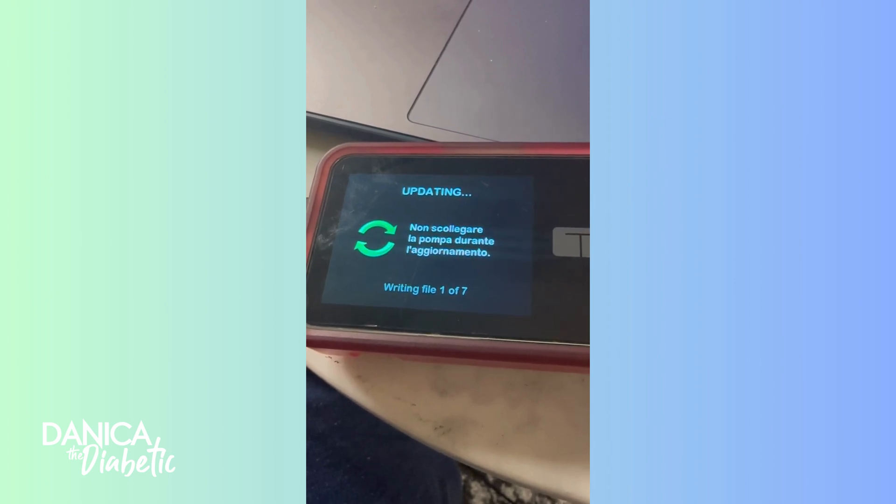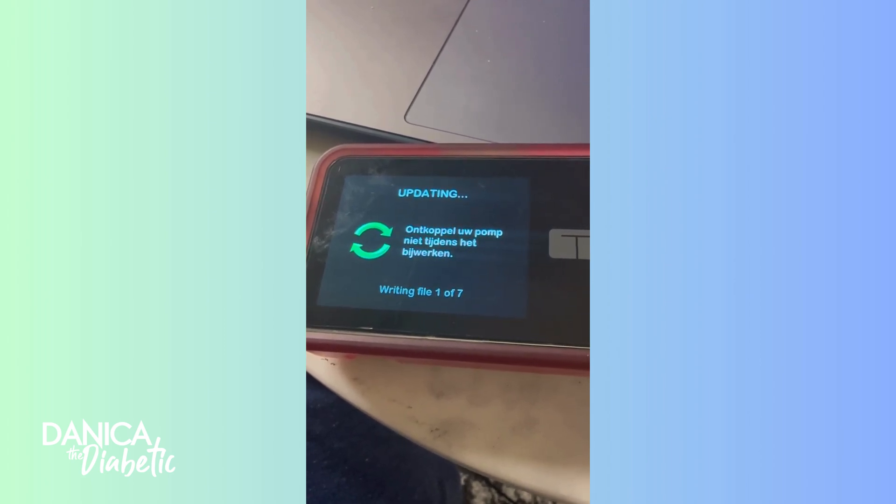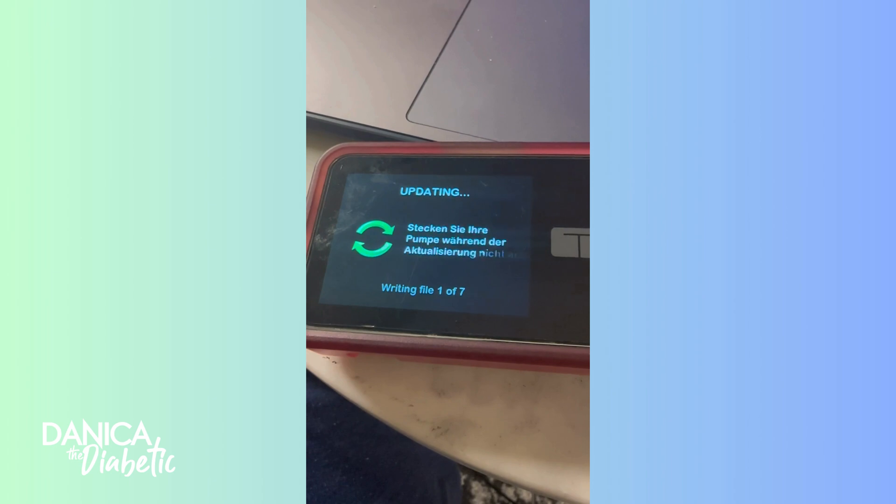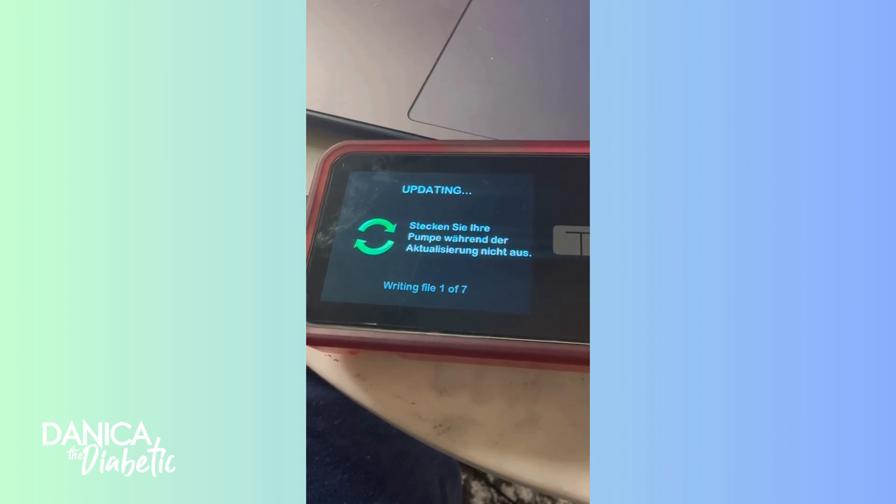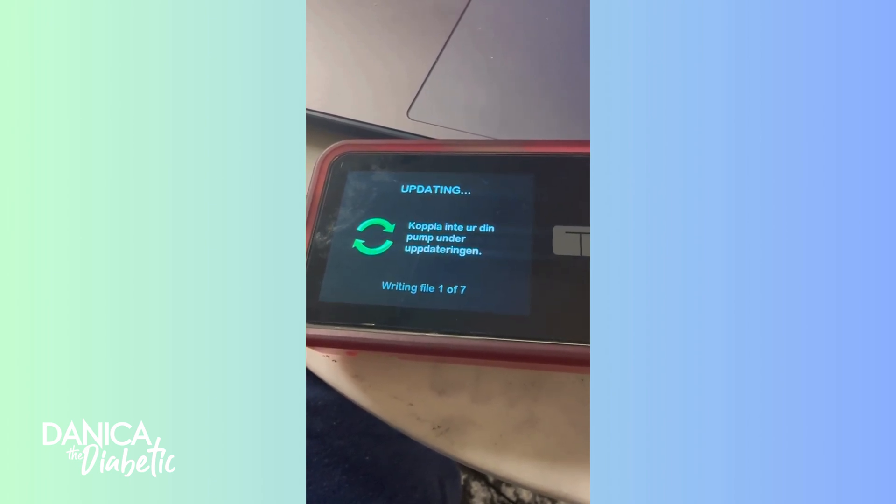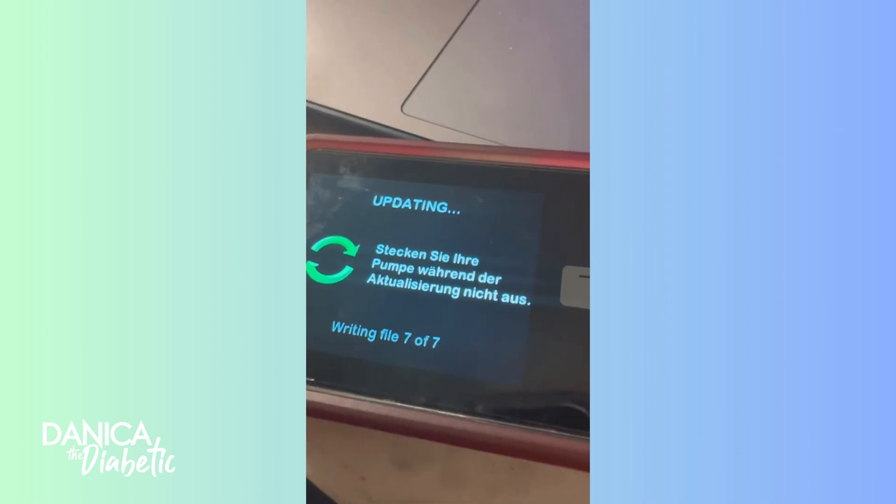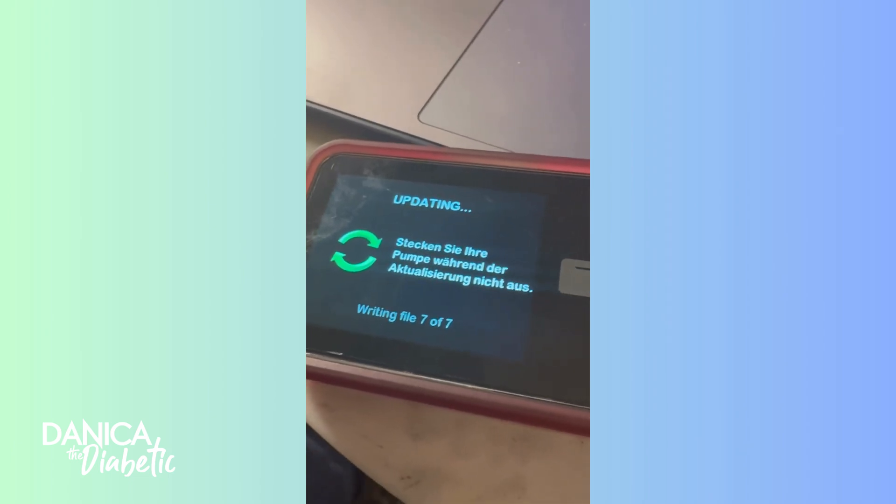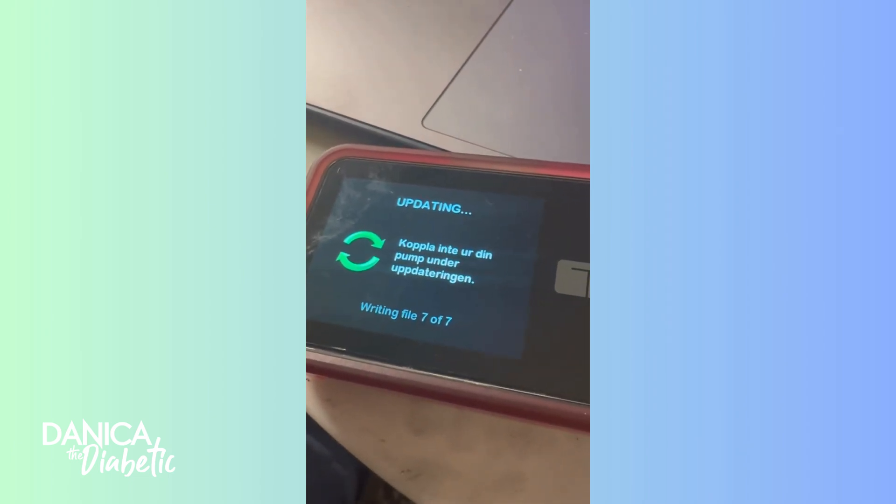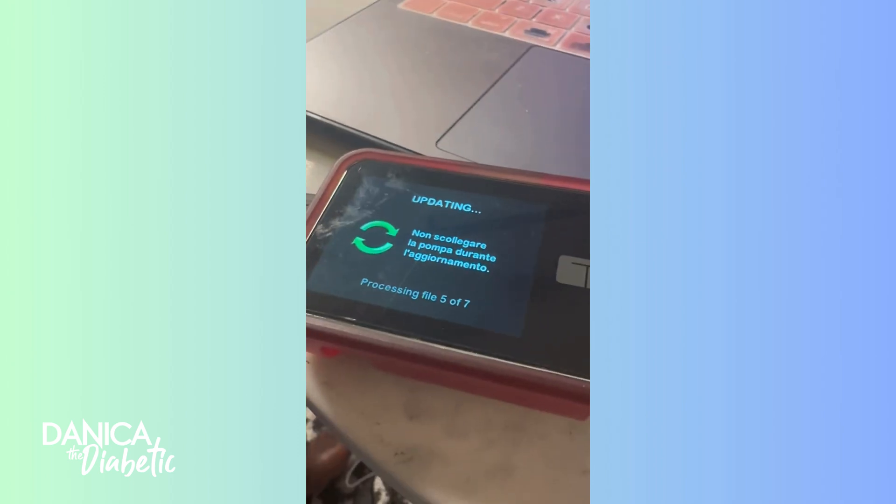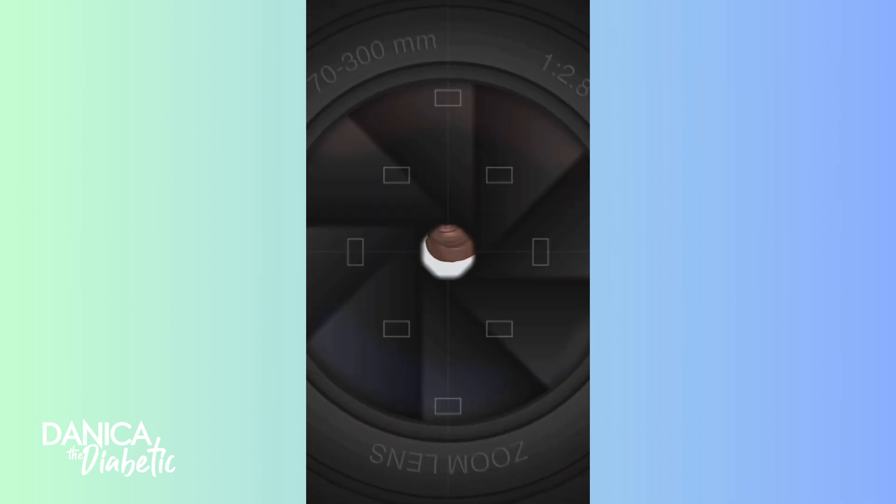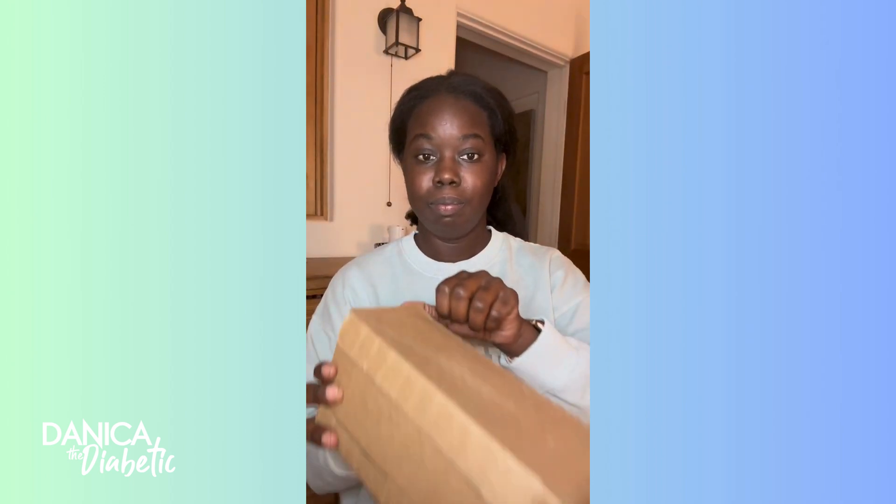It's writing these seven files and it takes a little bit of time, but if it's not plugged up, it's not going to work. And as this is going, you can see it just takes a little bit of time. It's writing the files and then it'll process the files. So keep it plugged up, have some patience because it takes a bit of time.